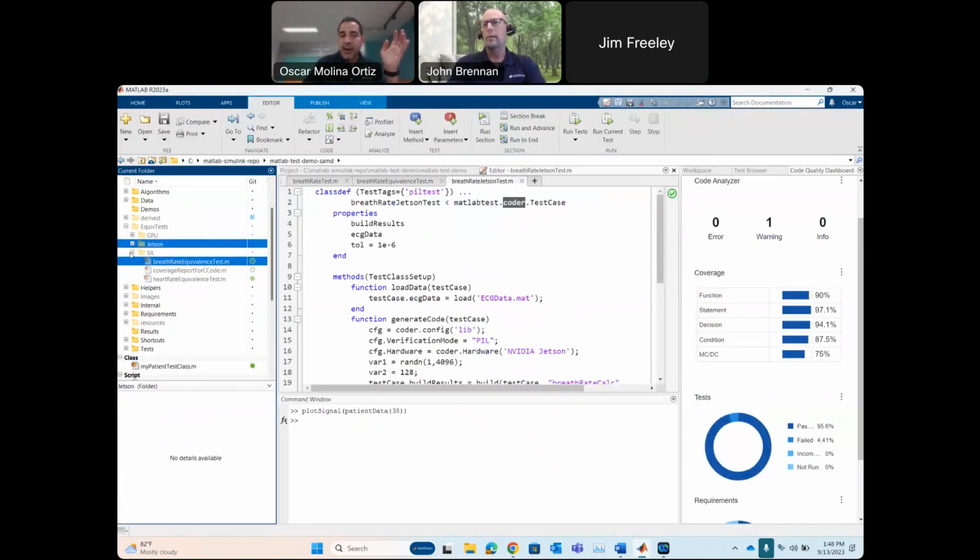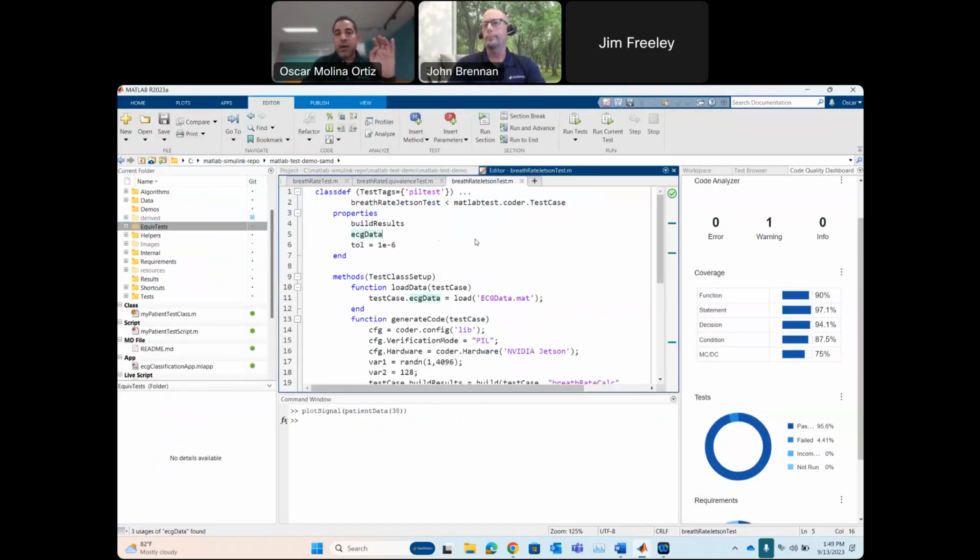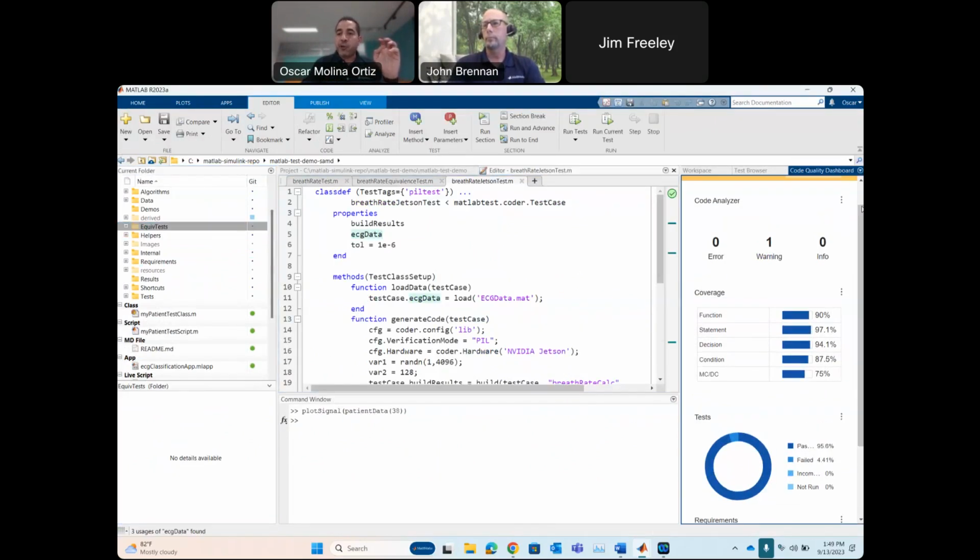So lastly, I wanted to highlight a couple more things. One is the persistence of your tests.